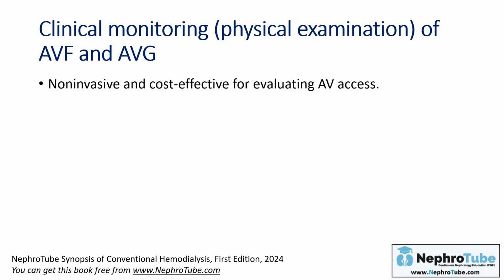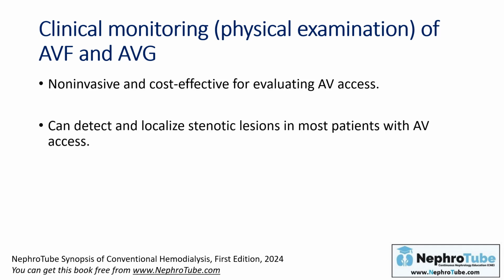and cost-effective, and it can detect and localize stenotic lesions in most patients with AV access. That's why KDOQI considered that it is reasonable for all nephrologists and health practitioners in hemodialysis units to be well trained on physical examination of AV access.